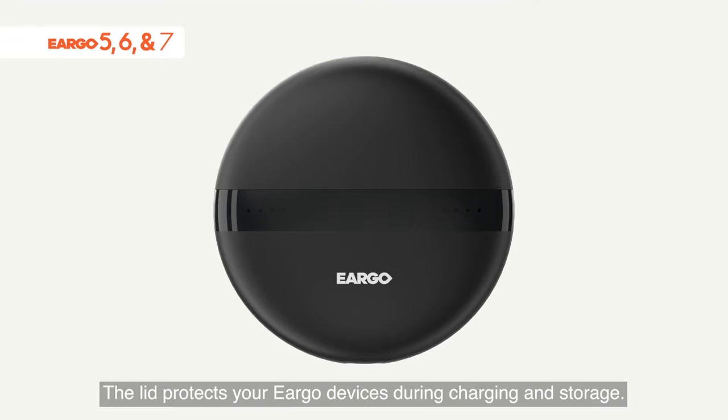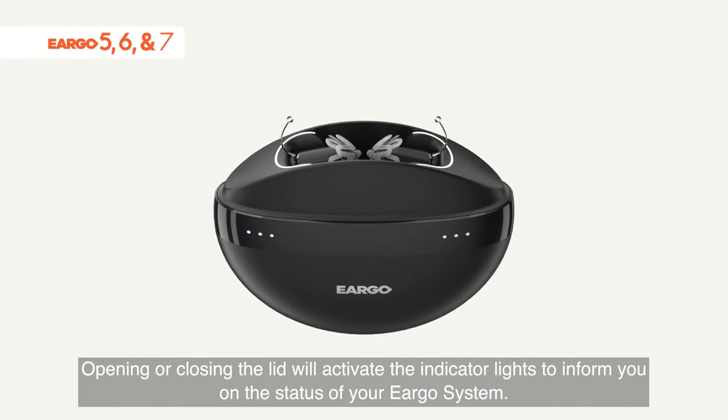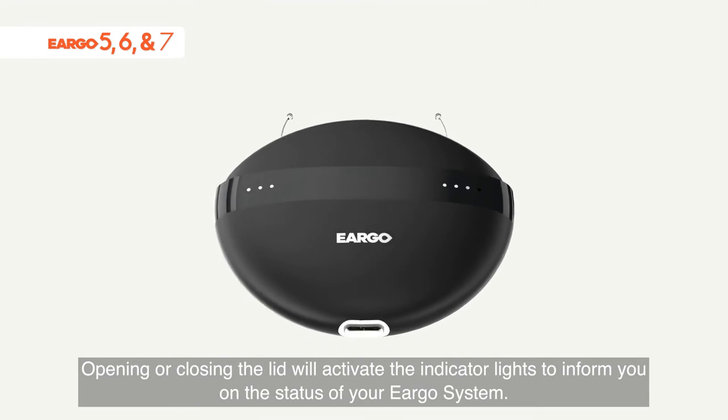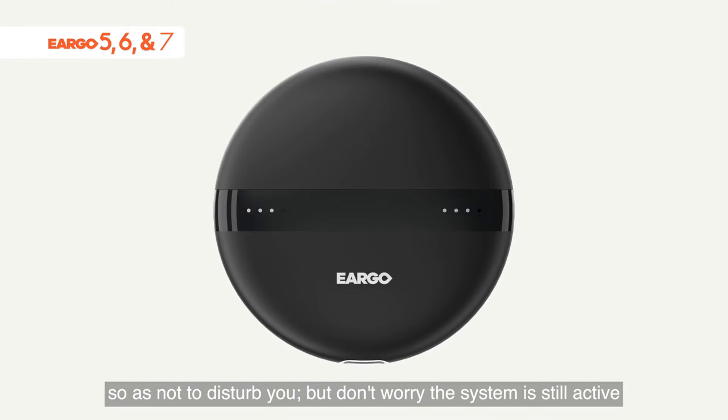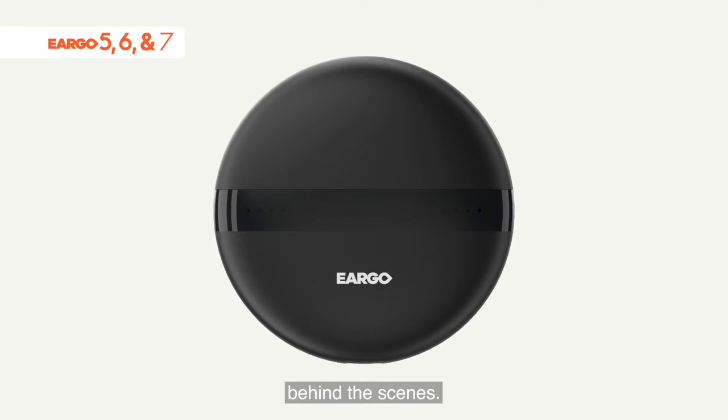The lid protects your Eargo devices during charging and storage. Opening or closing the lid will activate the indicator lights to inform you on the status of your Eargo system. Indicator lights will time out after about 10 seconds so as not to disturb you, but the system is still active behind the scenes.